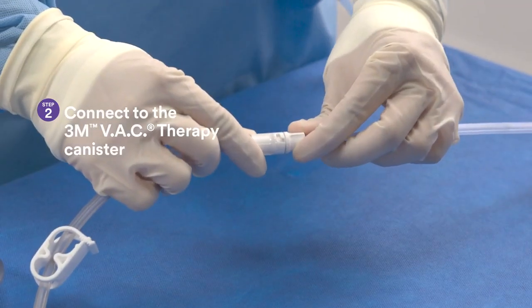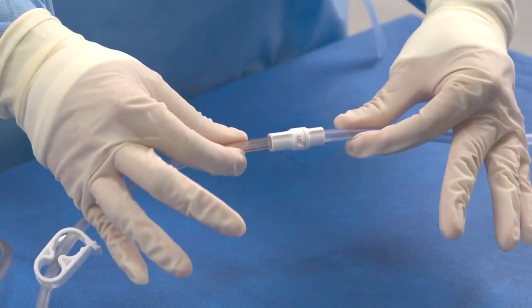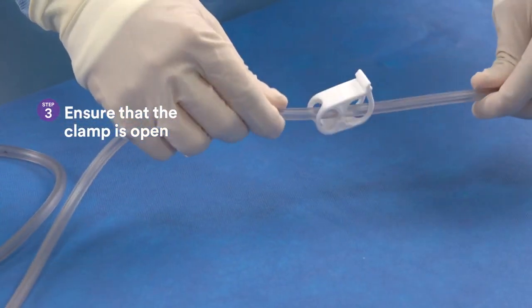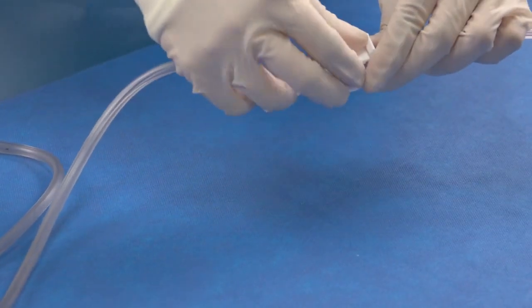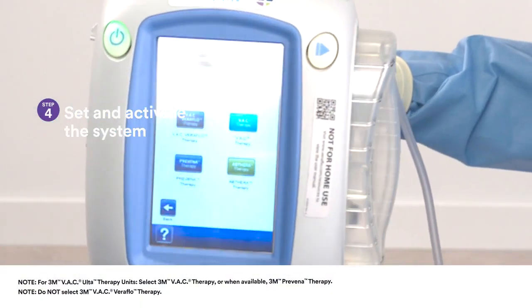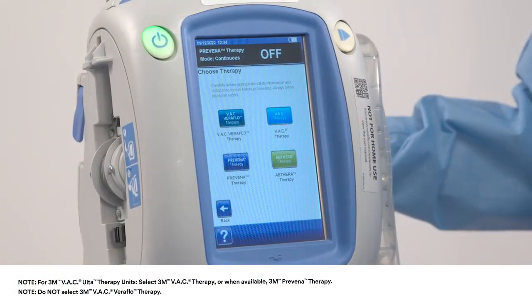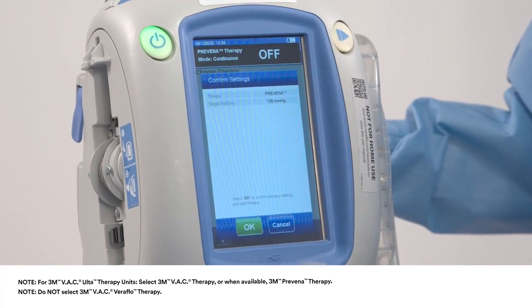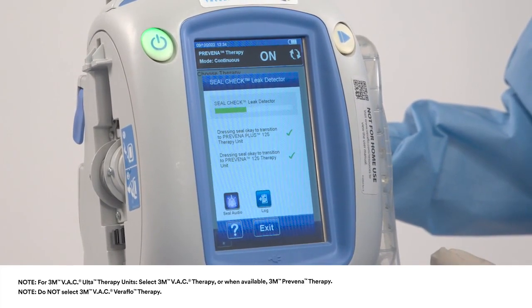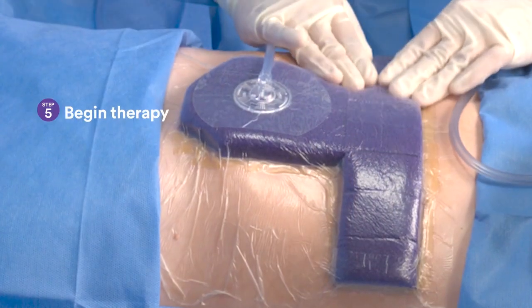Connect the Prevena Restor dressing tubing to the VAC therapy unit canister tubing by pushing and twisting the connectors to lock. Ensure that the clamp on the canister tubing is open. Set VAC therapy unit at negative 125 millimeters of mercury, continuous, and activate the system. Do not choose any other negative pressure setting or intermittent or dynamic pressure control therapy modes of negative pressure. Finally, begin therapy.